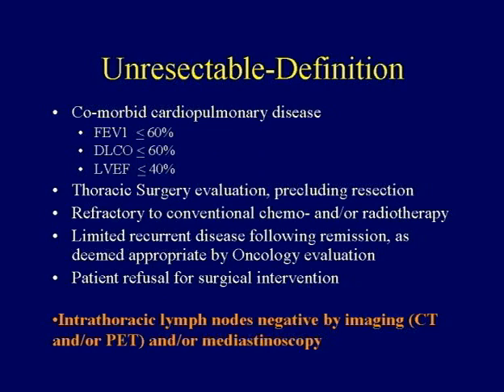As always in interventional radiology, you pick up the cases that nobody really wants to treat. So you start off with the sickest and the most complicated cases, when really our whole goal is to try and see whether this technique will work as a primary pathway for some of those early lesions. But that's how we started, and that's currently still the algorithm that is in place and is certainly part of the trials that are going on at the moment.